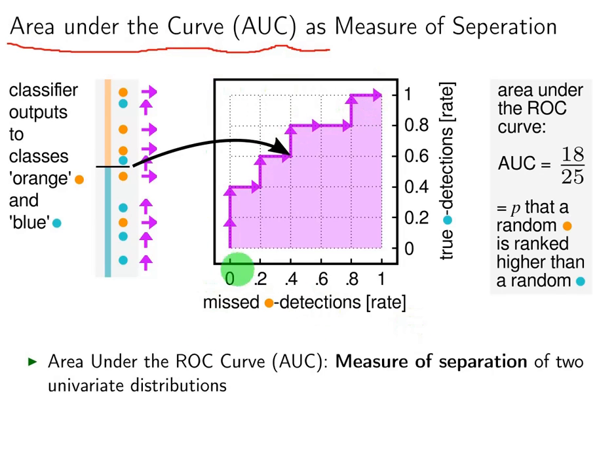This is the AUC curve, for example, where we have a misdetection rate represented on this axis, while true detection is represented on this one. So, misdetection of ERPs, true detection of ERPs, so the targets. If you take a look at the classifier outputs, we can see how the curve changes. Given this blue point, if it is correctly detected, then the true detection curve goes up.